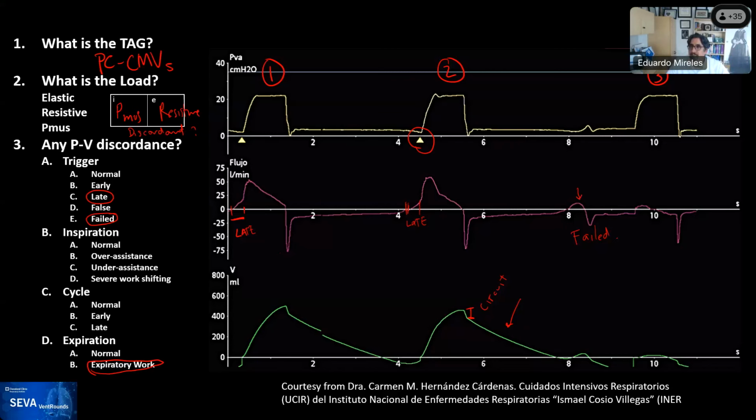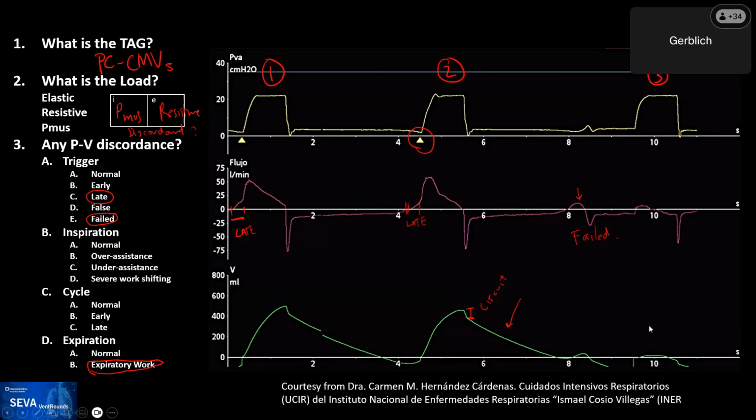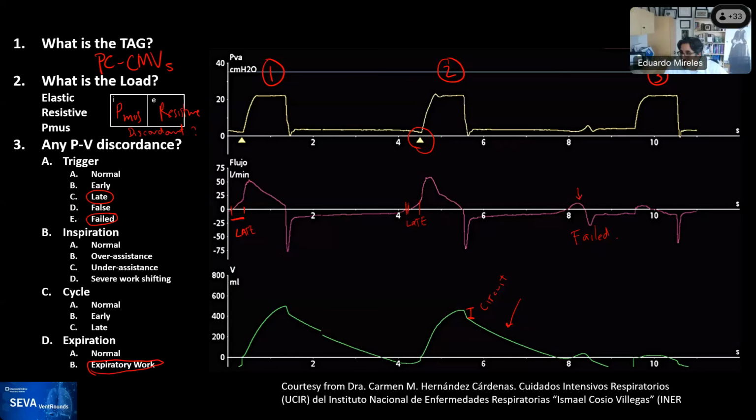So great point. Rob, I wanted to ask you, are you suggesting, I mean, I have a difficulty with your proposition. I like the idea about the ball valve, but I cannot agree that the inspiratory resistance is the same as the expiratory resistance. No, that's what he's saying, the expiratory resistance is higher. No, it's not. I didn't say that. You're right. So therefore, the time constant will be different. Yes, exactly. That was my point. That's exactly what he said. So I think that you guys are aligned. Oh, okay. All right, good.